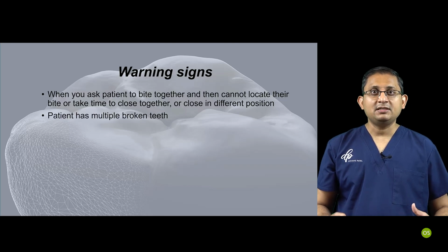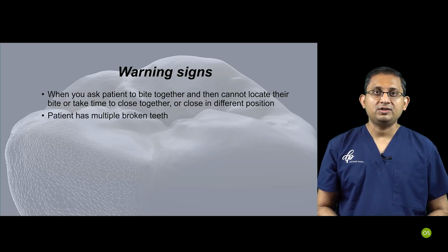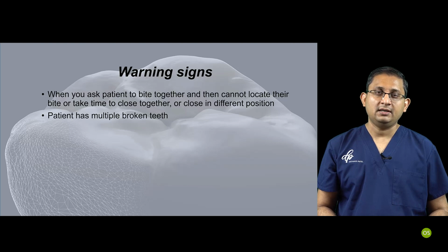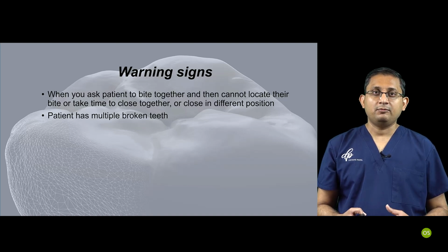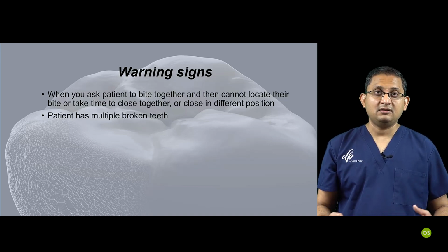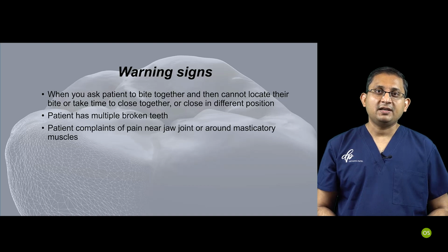The other sign is you can see multiple broken teeth or fractured restorations. If you see that, then you need to start doing a more thorough clinical assessment and find out why these teeth are fracturing, even though they are all heavily filled and doomed to fracture. You need to still investigate them, because I've seen many heavily filled teeth intact in some mouths, and sometimes you see teeth which are minimally filled but still fracture. So you need to assess this more deeply. Or sometimes a patient simply comes to you and says, I have pain in my jaw joint. If that happens, then obviously that's a real warning sign.